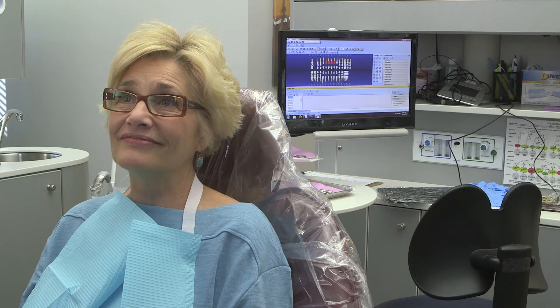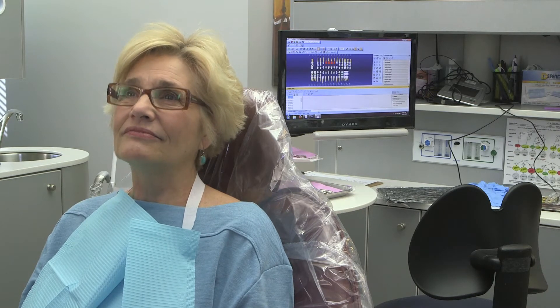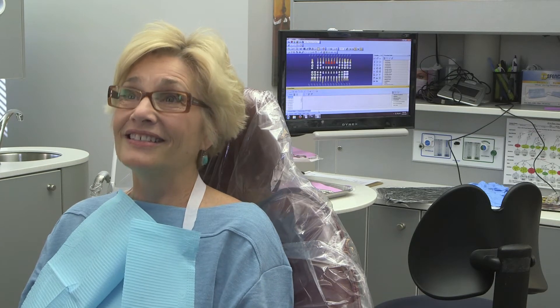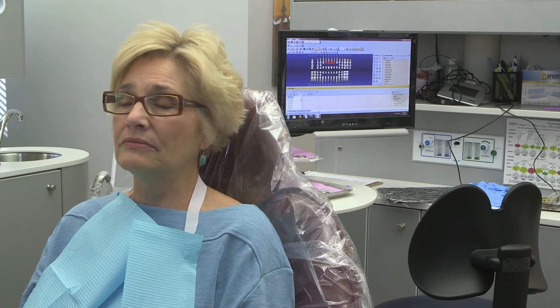When you bite down, do your teeth feel even when you bite together? Sort of, but not completely. Better since you've worked on my teeth? Yeah, not at all before. We've done numerous crowns and a few fillings and stuff. So it's better now than it's been, but it's still not what you would call perfect, right? No.